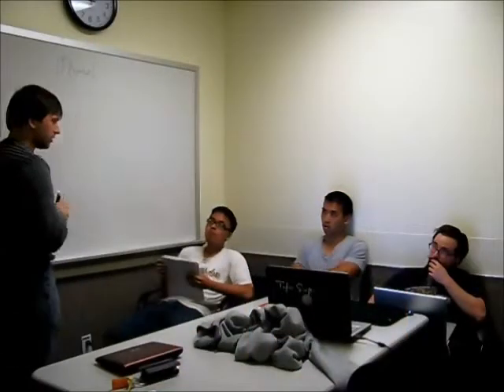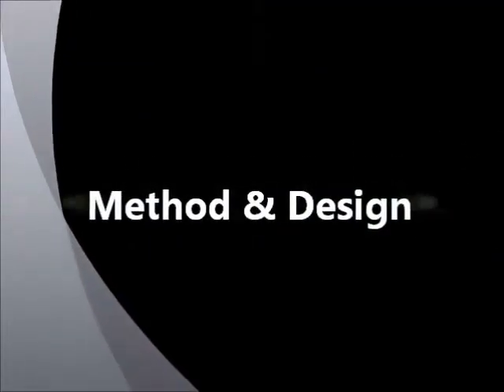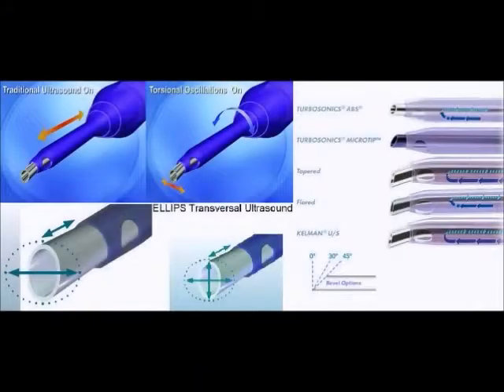So now that we have some knowledge of our project, we worked on several designs. Here's a summary of what we worked on. The technologies currently on the market are centered around changing the phaco tip for better efficiency. This involves various phaco tip motions, which include torsional, transverse, lateral, longitudinal, and various combinations of these motions.